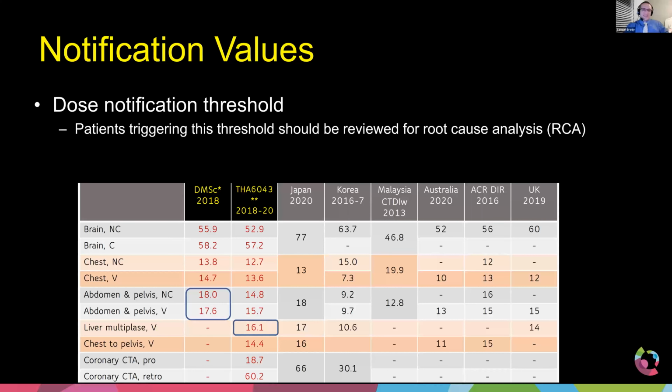Yeah, cardiac CTAs, a lot of them have been very well developed. And so most scanners, when you buy the scanner, it has some good CTA packages on it. But for whatever reason, if you don't, like I said, lowering your kV, using EKG tube current modulation, those are great ways to get the doses lower.